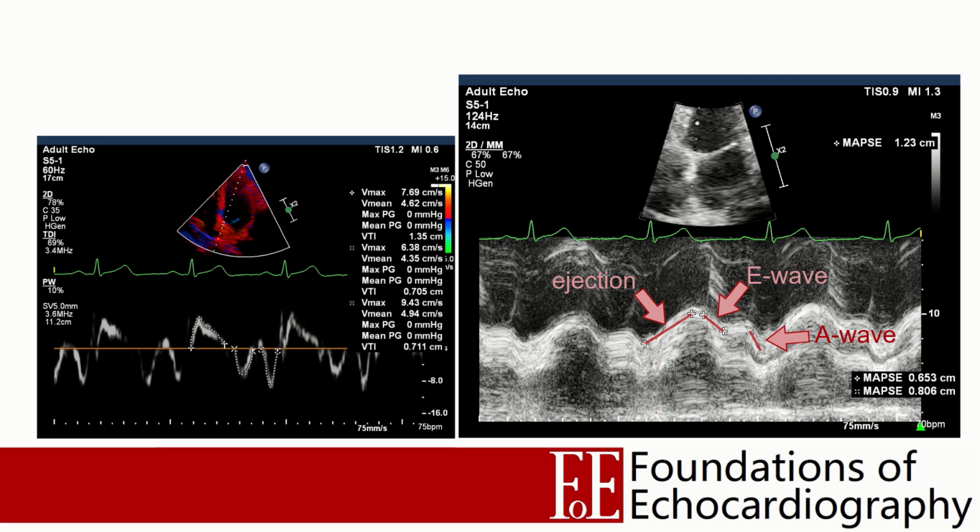Interrogating the M-mode image shows us that the annulus moves approximately 13 mm apically during systole, moving halfway back during early diastolic filling, and then the remainder of the distance during atrial systole, which is essentially the same pattern that we see in our tissue Doppler graph.